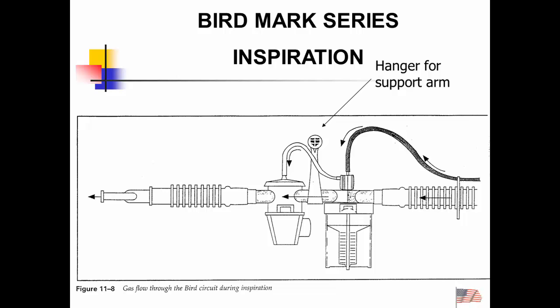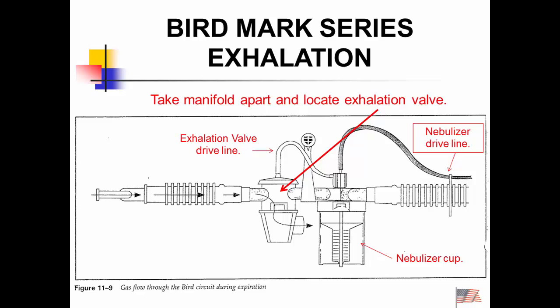So again, here's my little jumper that I was talking about. As positive pressure pushes, it not only causes nebulization to occur, but it's also causing that exhalation valve to remain closed. During exhalation, then, there's no pressure on that valve, so then the patient's allowed to exhale back out through the expiratory port, and this is where I would hook up my respirometer to.